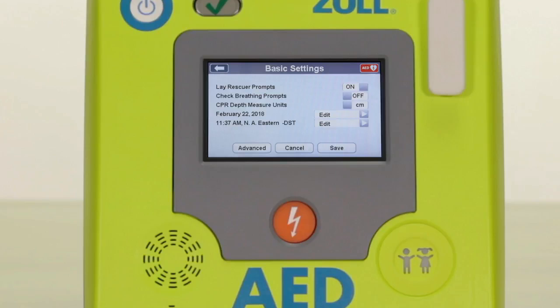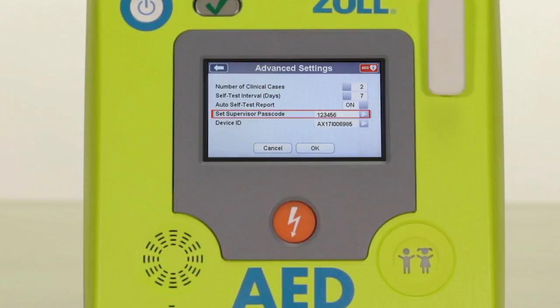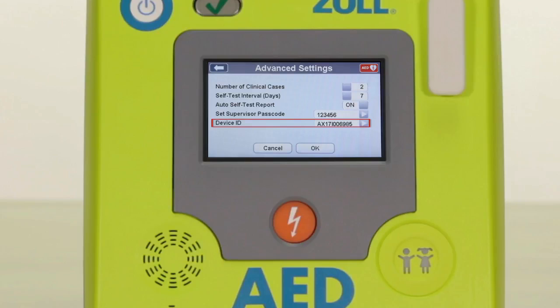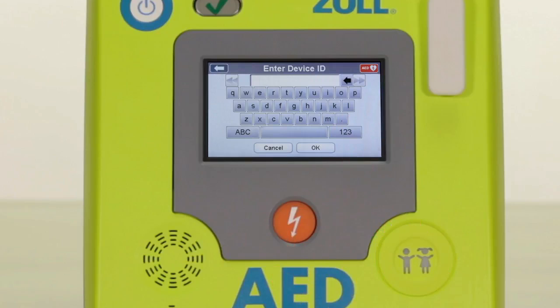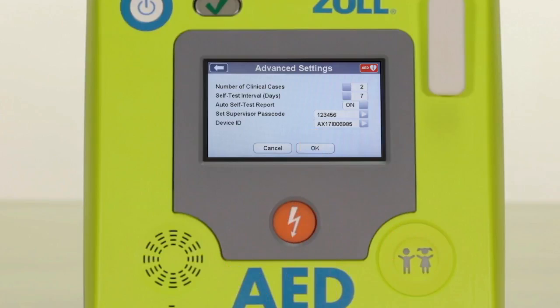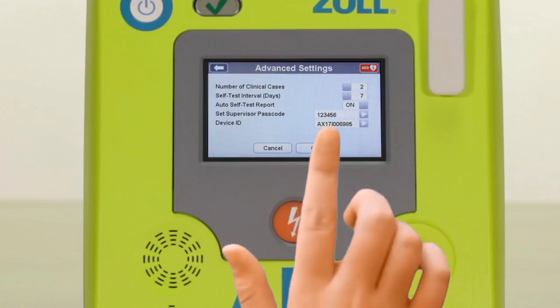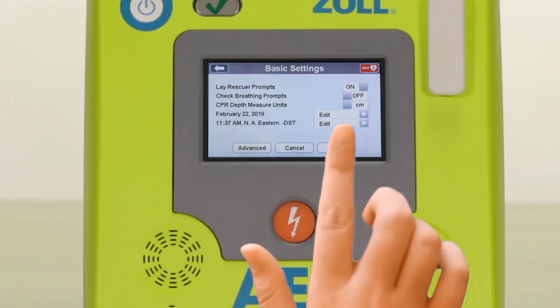You can change your passcode by selecting advanced settings from the bottom left of the screen and then setting up your new supervisor passcode. Make certain you write down your new passcode before you save and exit the advanced features area. The device ID is the serial number of the AED by default, but you can change this — for example, you may wish to identify the AED by the address of a building or its location in that building. Simply touch the device ID box, type in your preferred ID, select OK to return to the previous screen, and then press save to confirm your configuration changes.